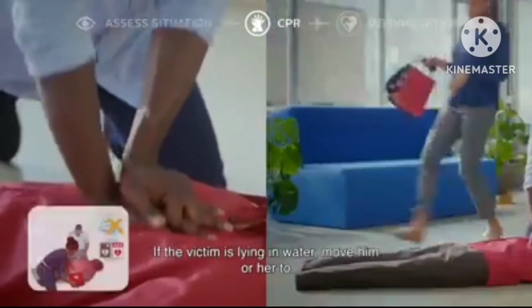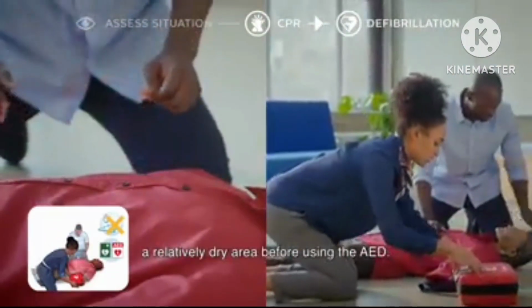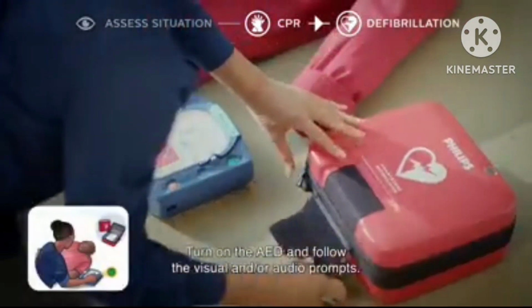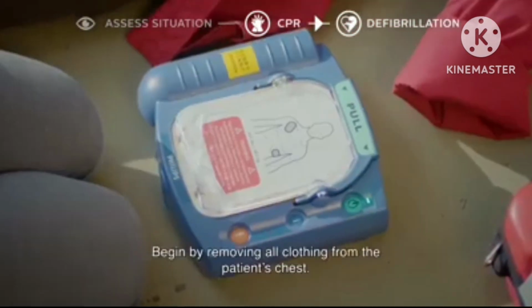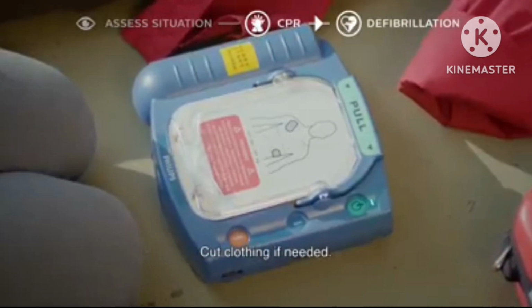If the victim is lying in water, move him or her to a relatively dry area before using the AED. Open the AED box. Turn on the AED and follow the visual and/or audio prompts. Begin by removing all clothing from the patient's chest. Cut clothing if needed.